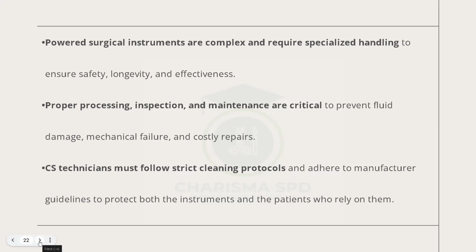Even though water is supposed to touch it, it must not be left in water for several hours unattended. So their treatment is basically the same. Fluid invasion is the number one cause of powered surgical instrument damage. You might see a question like that.